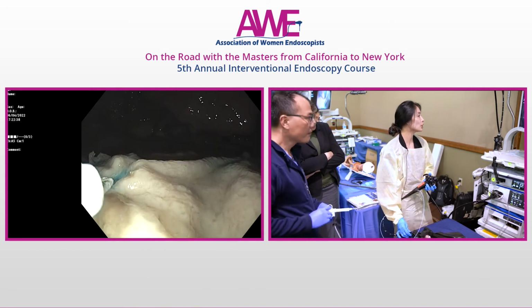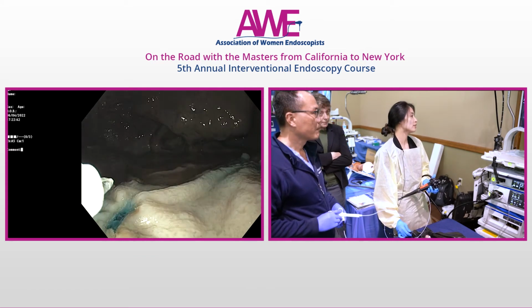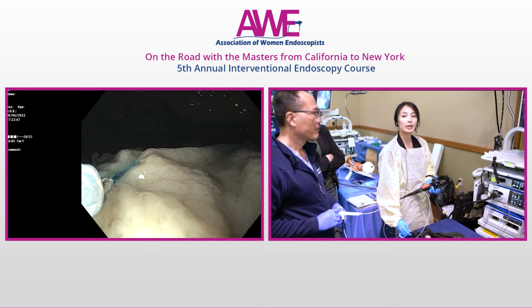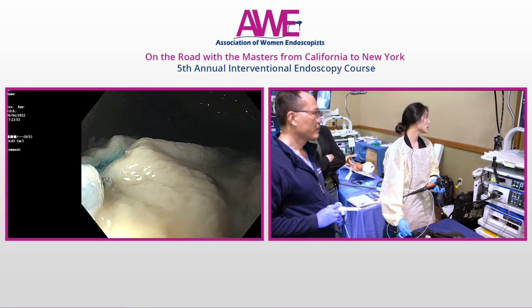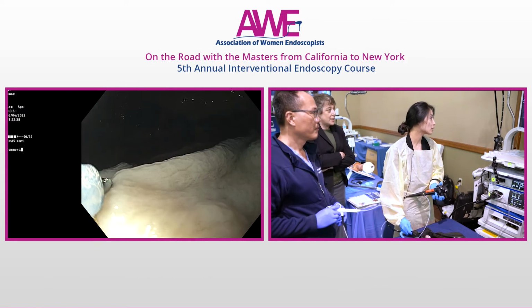So the next thing we'll do is snare tip. We'll imagine that we have some snare tip soft coagulation settings there, and we just have a few millimeters of the snare tip out, and using the blue pedal, soft coagulation, we're just going around the margin of the defect.